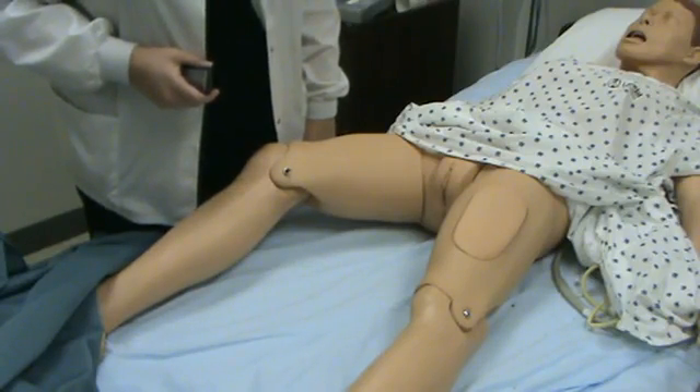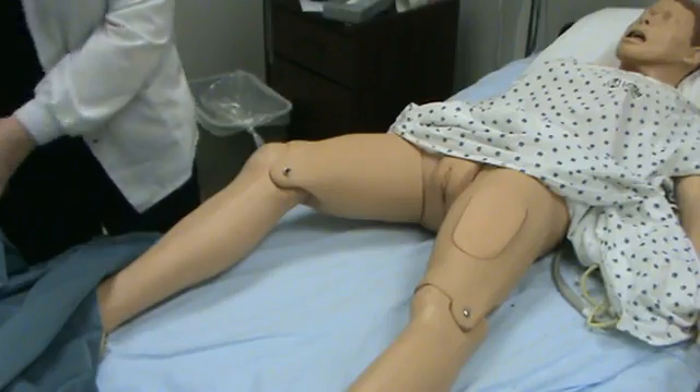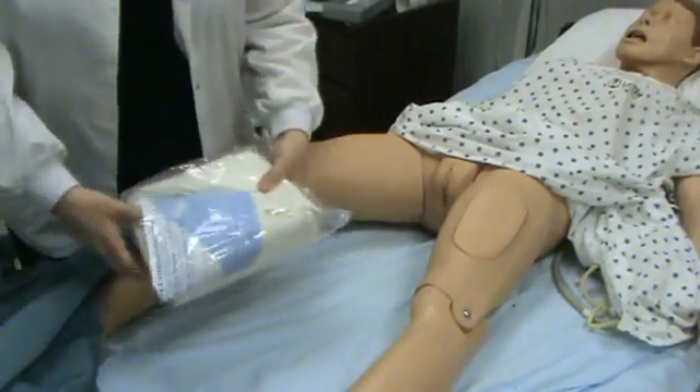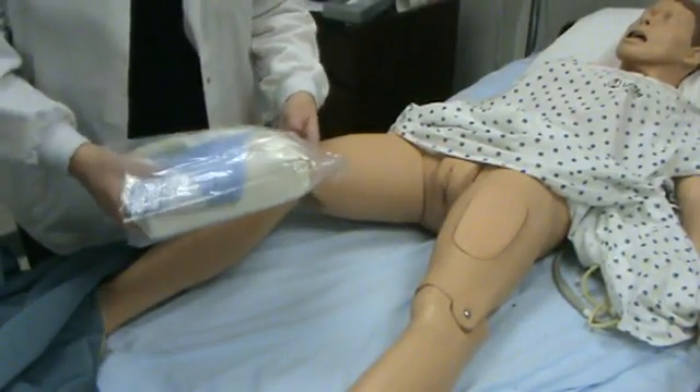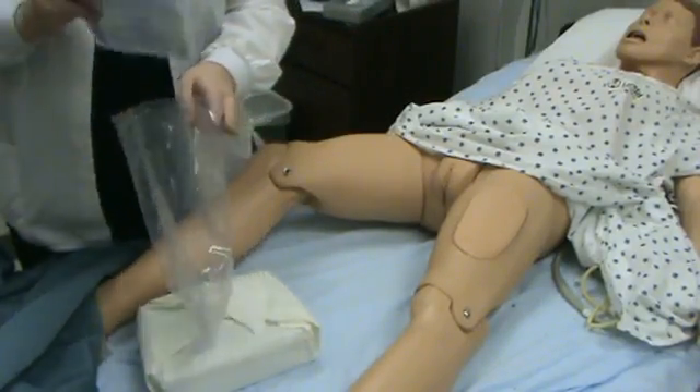Today we are going to be performing the female Foley catheter insertion. This is what your typical catheter insertion kit looks like. I removed the plastic bag and this is used as my garbage.